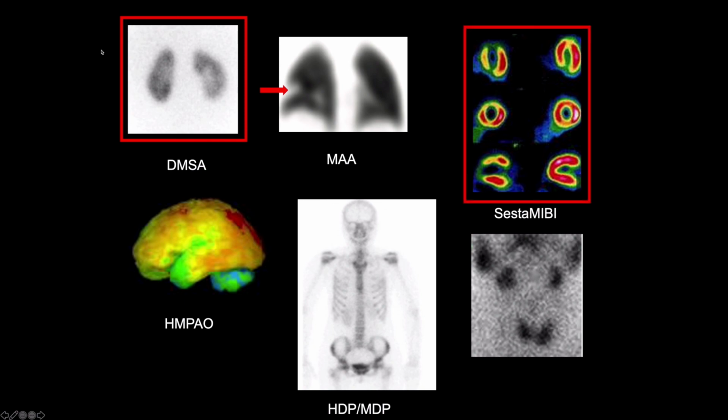This is a sestamibi scan, which has been done for cardiac imaging. For patients in the moderate risk group of coronary artery disease, we might want to see if there is a significant inducible ischemia that warrants a trip to the angiocatheter lab. You can see with the green arrows there is normal uptake in the left ventricle during rest. Whereas when we put the patient under stress by making them run on a treadmill, for example, and then image their heart after that, you can see big sites of reduced uptake at the apical, anterior and septal walls, very indicative of inducible ischemia in the left anterior descending artery territory. So we would tell the cardiologist that is where they need to target their stenting.